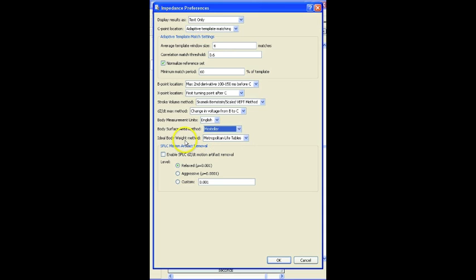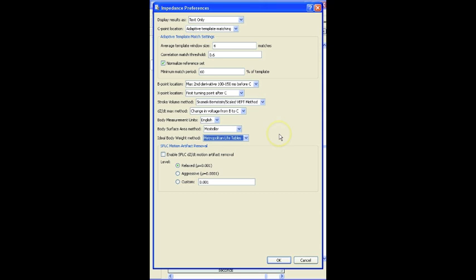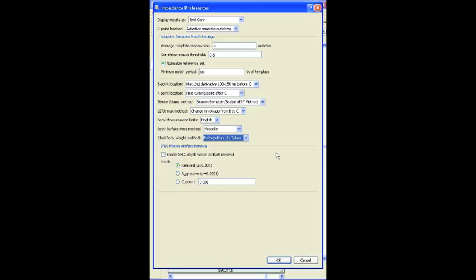This final option down here allows you to turn on a scaled Fourier linear combiner. This is very useful if the data is extremely noisy and the software is unable to identify the components within the DZDT signal.